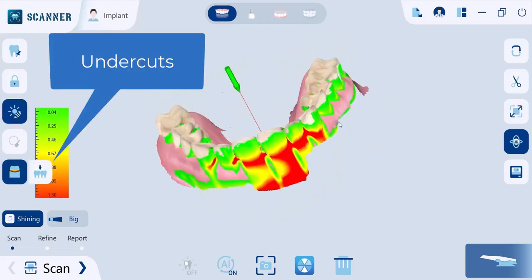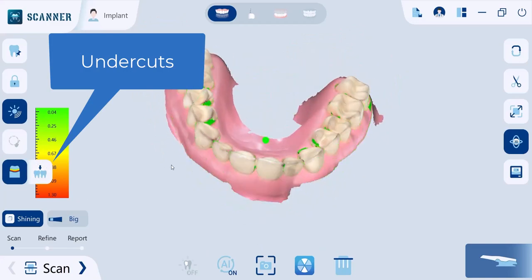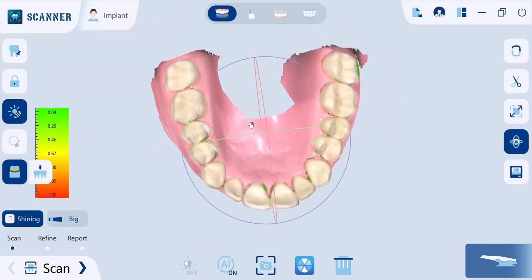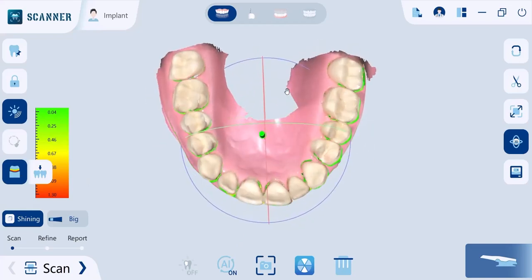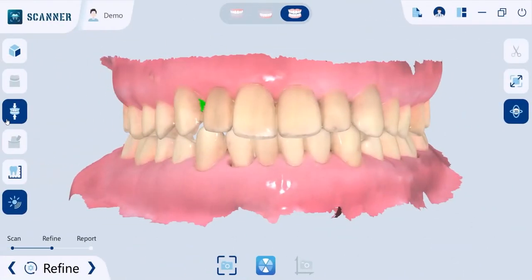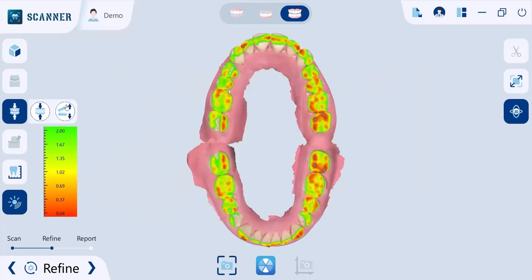Check the undercut areas on the preparation site with the undercut check tool — it works in the direction where you place the model. You can also have an occlusal analysis that analyzes the interference between the maxilla and the mandible and displays the result through a color map.